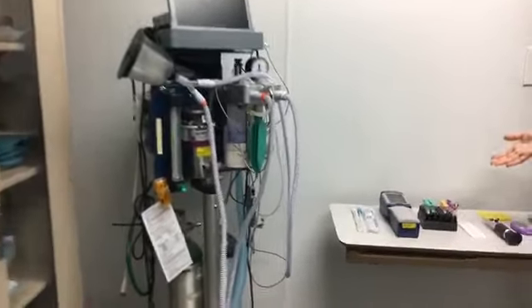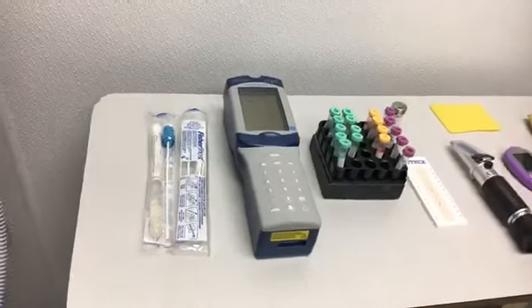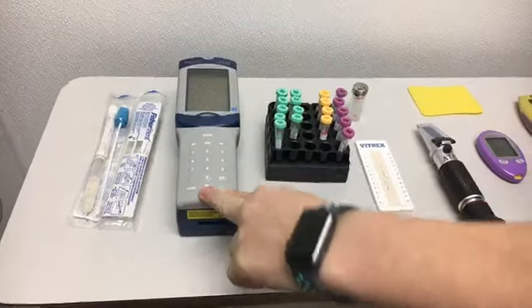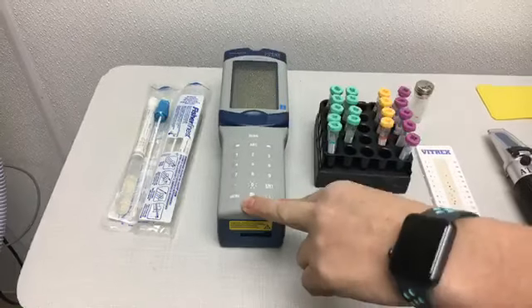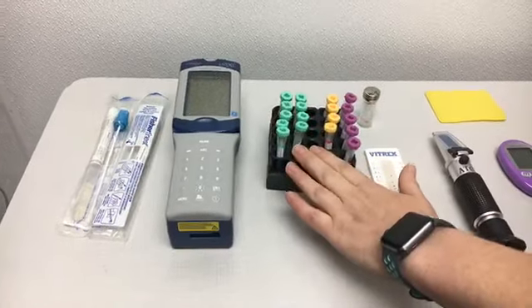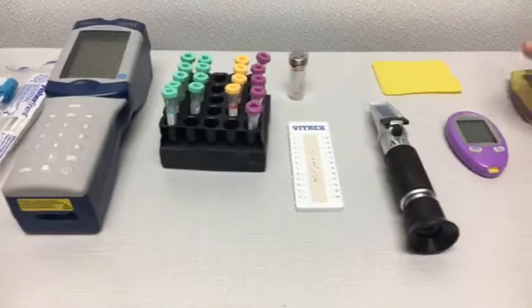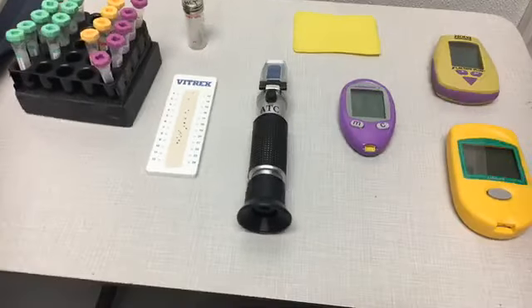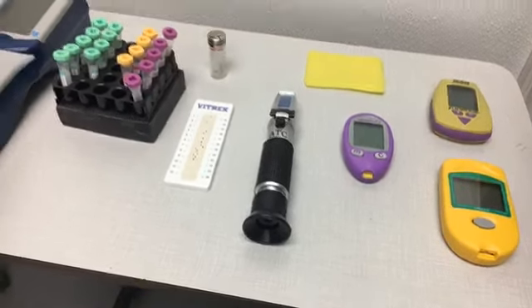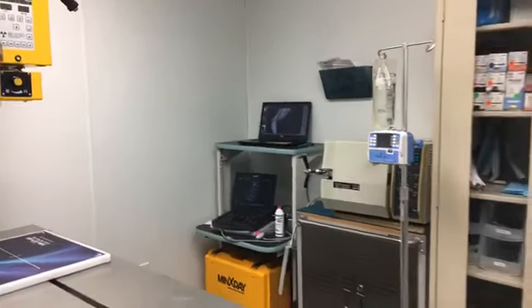Here on this counter we've got some of our lab equipment — various things that we use. We have our iStat which gives us some chemistry values so we can check kidney values and liver values to see if an animal is doing well. We've got some blood tubes, different types depending on the test we want. And some monitors where we can monitor single things like glucose, which is how much sugar you have in your blood. I believe we are ready to come back into the front room and take a look at Mr. Wilson's exam.